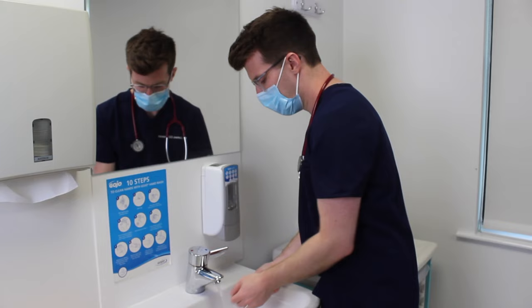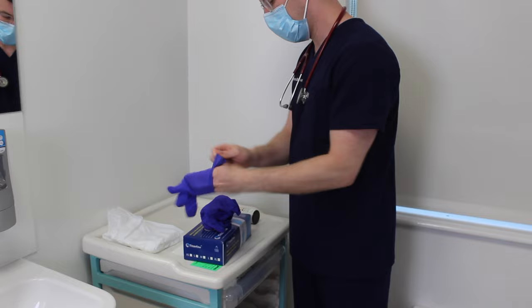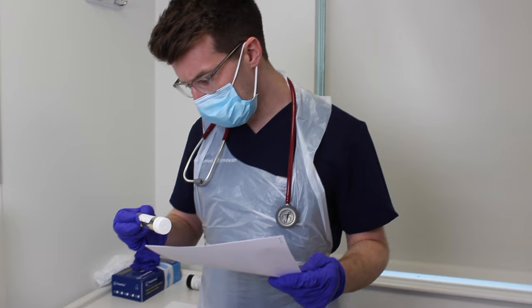Start by washing your hands and wearing PPE. Check that the details on the sample bottle are correct and match the patient identification details.